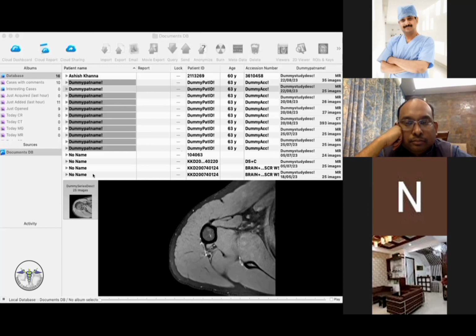So the percentage of bone loss is the thing which we are always more interested in. Earlier, we used to get the CT scan done in addition to the MRI, but with your circle method, we're getting MRI only. Because if bone loss is 20% or more, or different people have different criteria, we would like to replace bone with bone rather than doing a soft tissue procedure, because chances of failure of soft tissue procedures in higher bone loss are high. Okay. That's what Akram wanted to say.